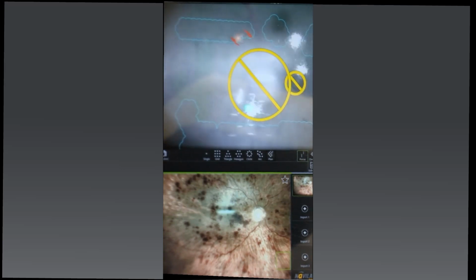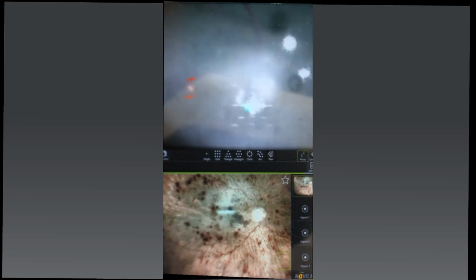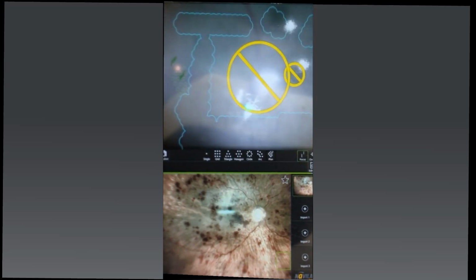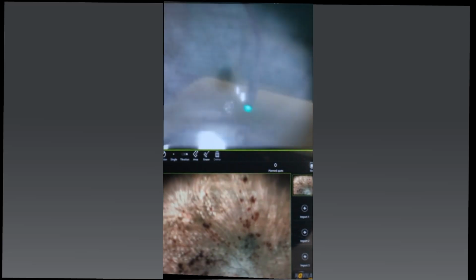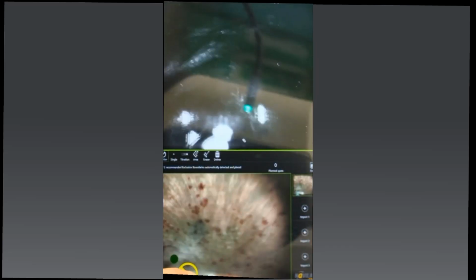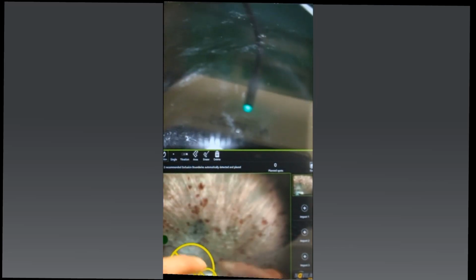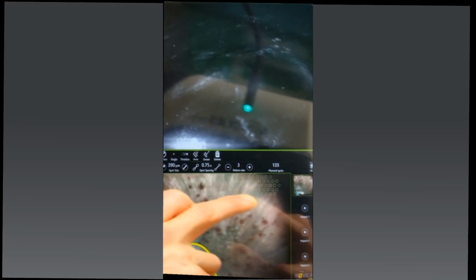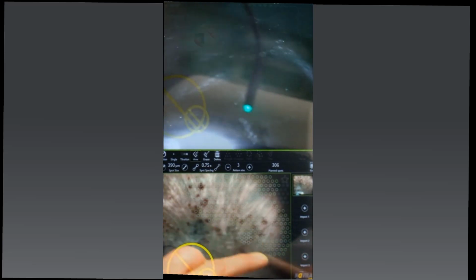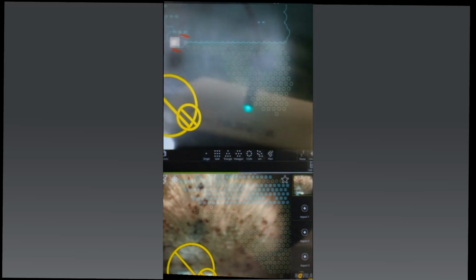With these patients it is under-treatment. The problem is the hemorrhage and the swelling have limited the amount of PRP uptake up to this point. And really the only thing is you've just got to get decent treatment on there fairly quickly. I mean, obviously there's patient variability. Some patients would find that more difficult. You gauge the patient quite quickly, I think, as to how much they can cope with.